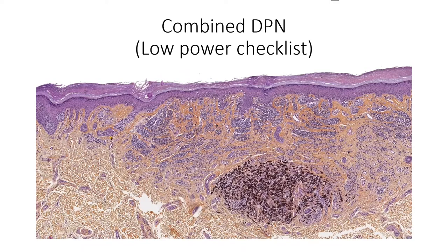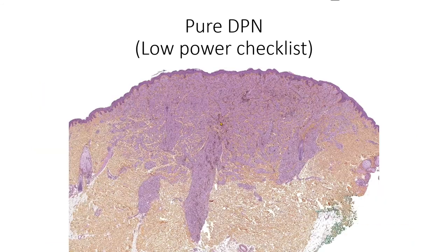Another case with a common nevus and the clonal area with many melanophages. For pure DPN, there will be no clonal area or common nevus. The whole lesion is of DPN subtype, and there's often vertical expansion into the subcutis. You can also see the grid of melanophages.